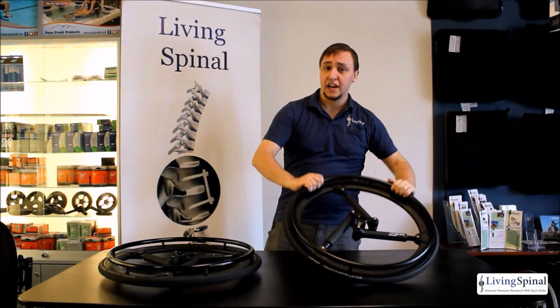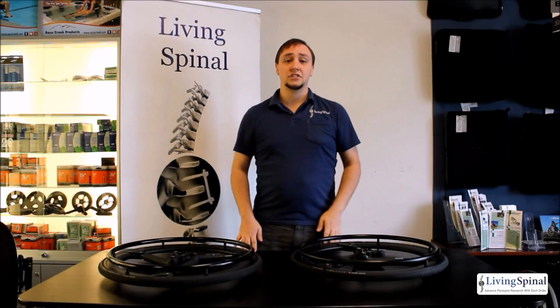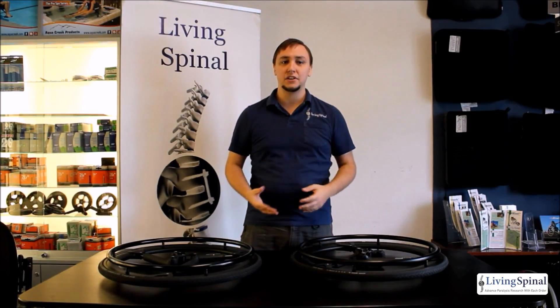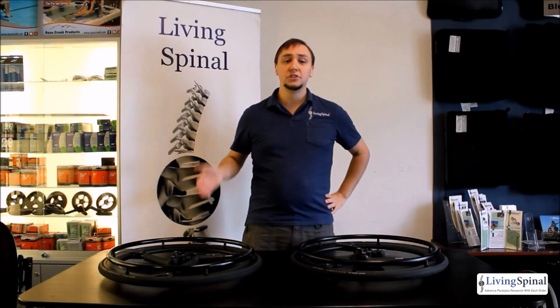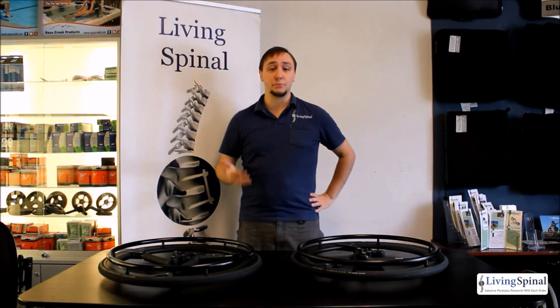When you're choosing these items at checkout, you'll notice a couple of different options. First is the size — we currently only offer these wheels in 24 inch and 25 inch. You have the option of purchasing just the wheel, but we also offer a full wheel option which includes the tire, tubes, and hand rims for your Soft Wheels. You can find this in the drop down on the product page.